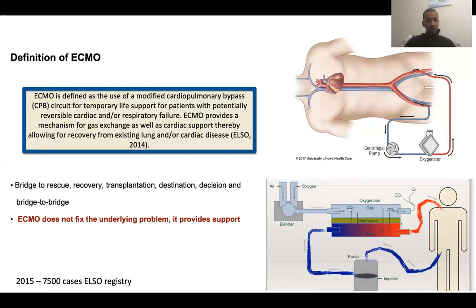Right, it goes through the lungs. So here you are expecting that the right ventricle is actually intact in terms of heart pumping function, and although it passes through the lung, it does not have any meaningful oxygenation in the lungs, and then just bypasses the lungs and goes back into the left side. So ultimately, the oxygenation, whatever it got from the machine, goes through the lungs and eventually goes on to the left side. Okay, so that would be an example of a VV ECMO.